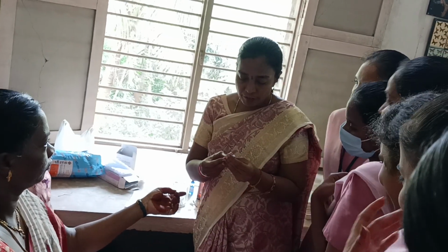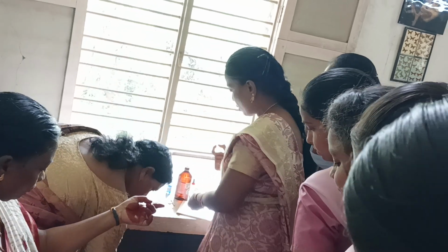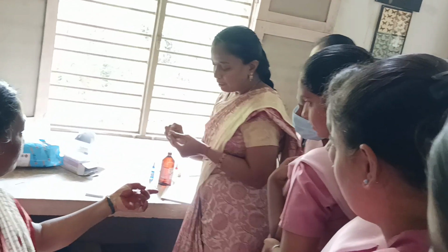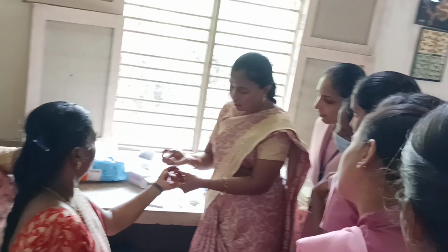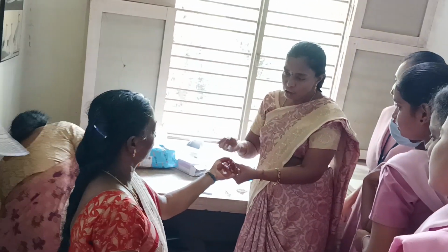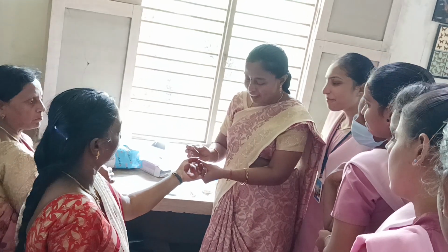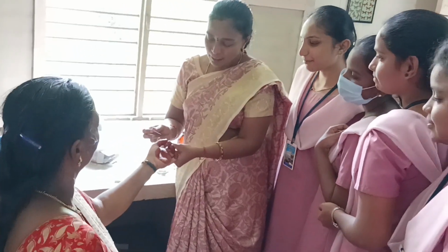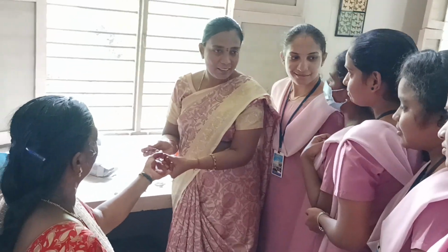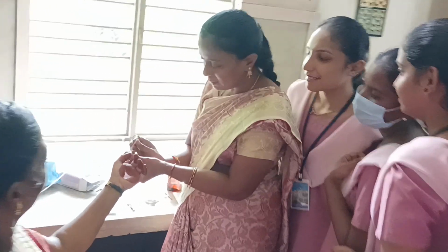Now we have to take a disposable needle, which is only of one use. Whoever we are doing the blood grouping test on, we should first motivate the person not to panic. Even if we are taking a small drop, if they panic, then it won't be an accurate result. So, just a small prick.